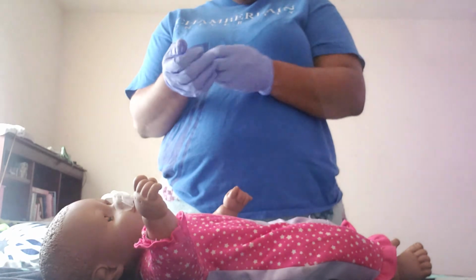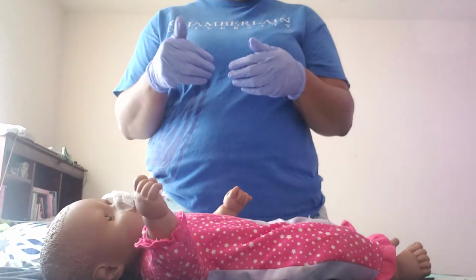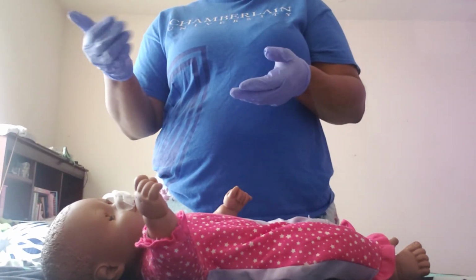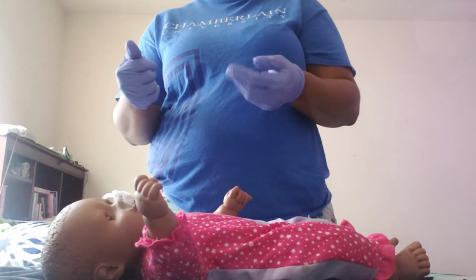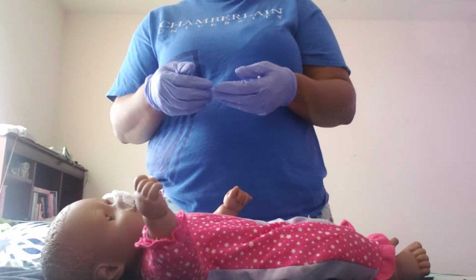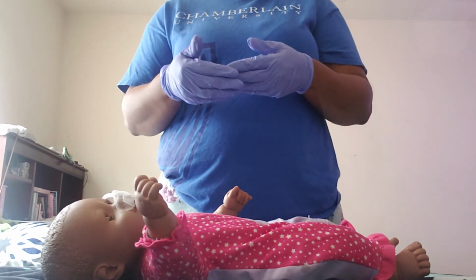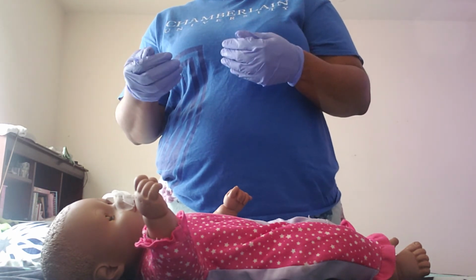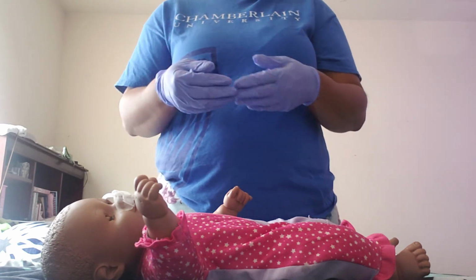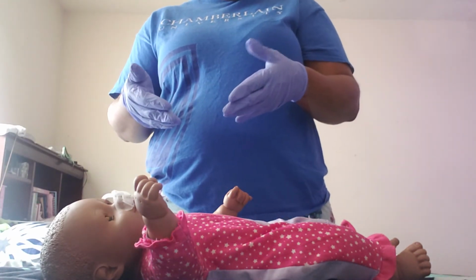So then I'll take off my gloves and perform hand hygiene, but since we are going to go ahead and remove it, I'll keep these gloves on. But any other time you come back into the room, you will introduce yourself again, perform hand hygiene, and let the patient know you're going to go ahead and remove the NG tube. You'll also let the patient know that upon removal, you may experience some gagging. And so that may take place.